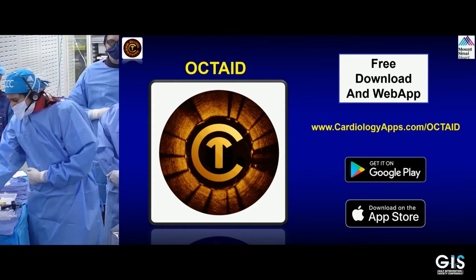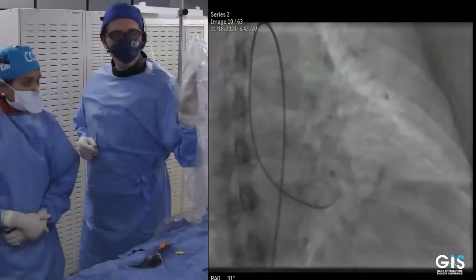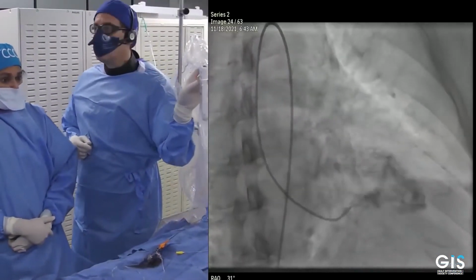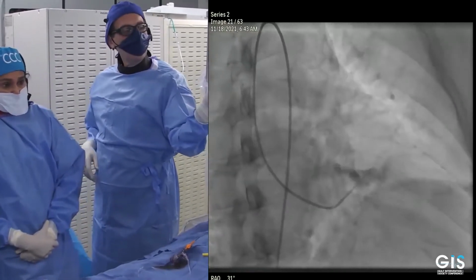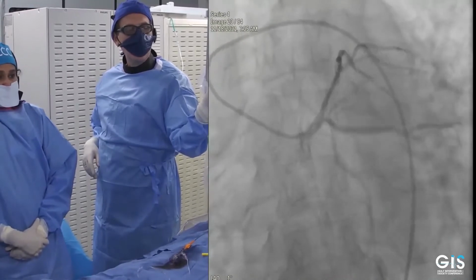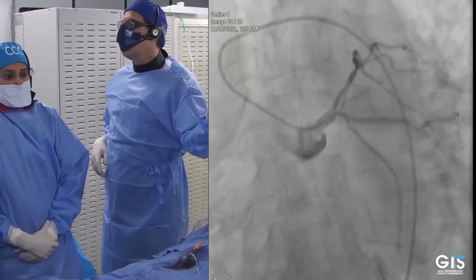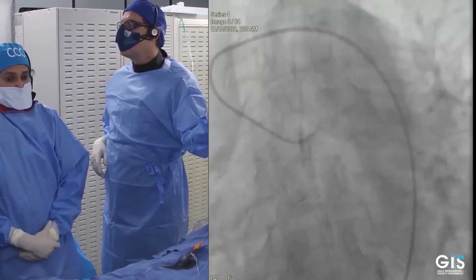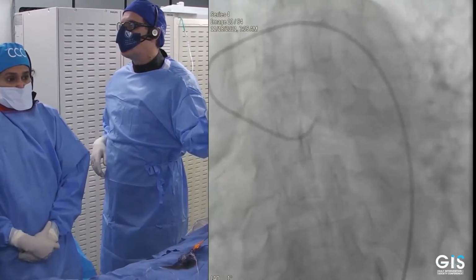So here we are going to show you the angiogram. Please, yes, let's go to the angiogram. We see, yeah, very good. LV gram, good LV function. Dr. Kinney told you the RCA is not so significant. You can see that very clearly. The circumflex is not too bad, and the stent is patent, in the early OM or high lateral.